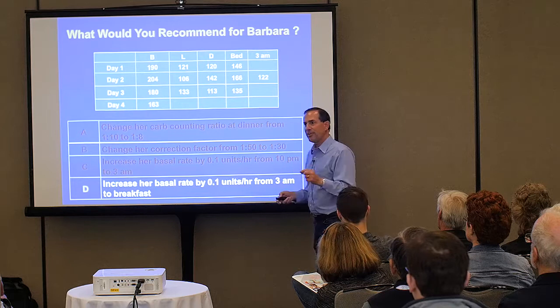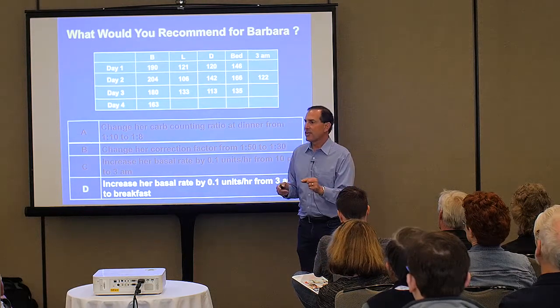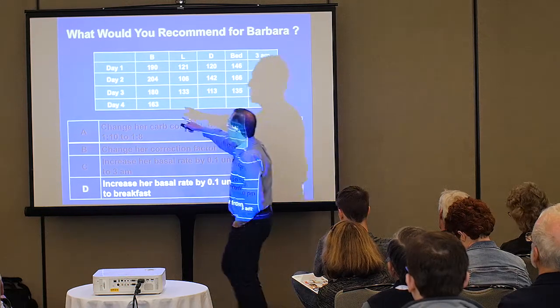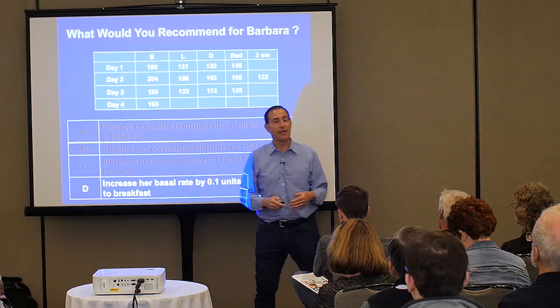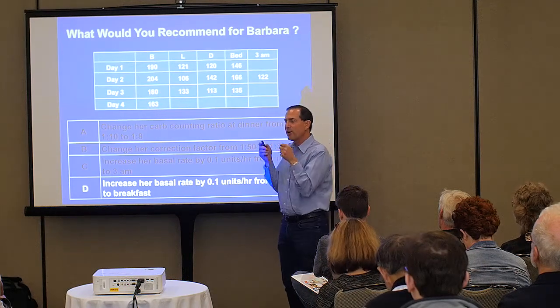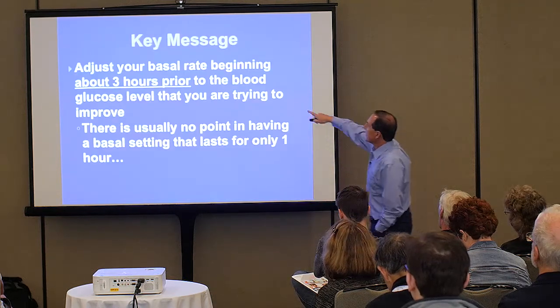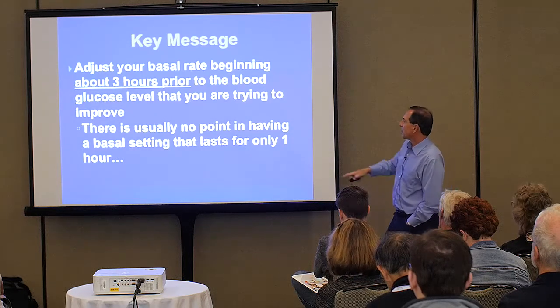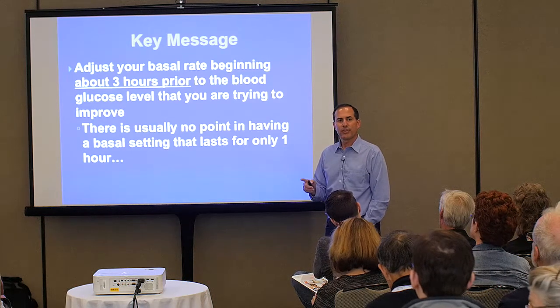So when you're changing your basal rate, just like you're helping this lady, make the change 3 hours before the problem time. So if you're high at 7 a.m., don't change your basal rate for 6 a.m., change it for 3 a.m. or 4 a.m., at least 3 hours before. I find a lot of people know the idea, you need more, but don't go back far enough in time. So adjust your basal rate beginning about 3 hours prior to the problem. There's no point in general for having a basal rate set for just 1 hour.